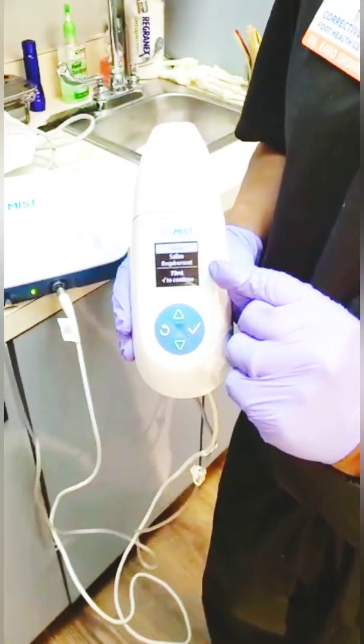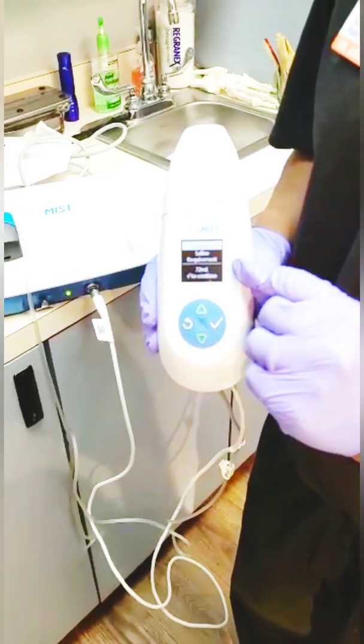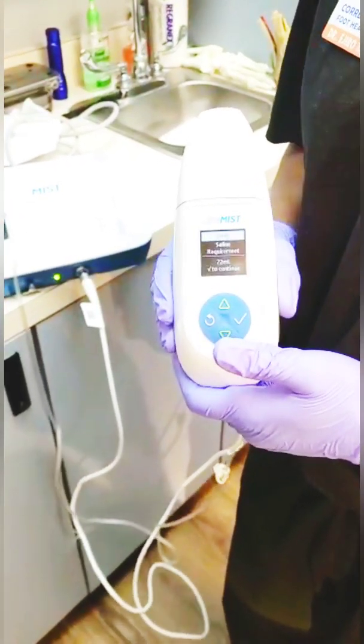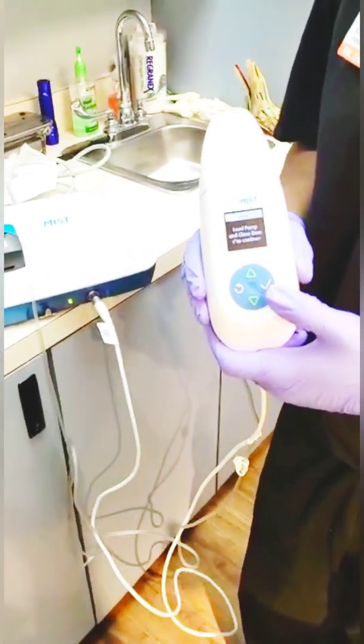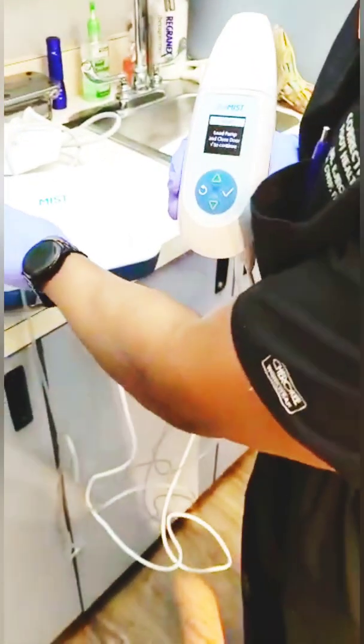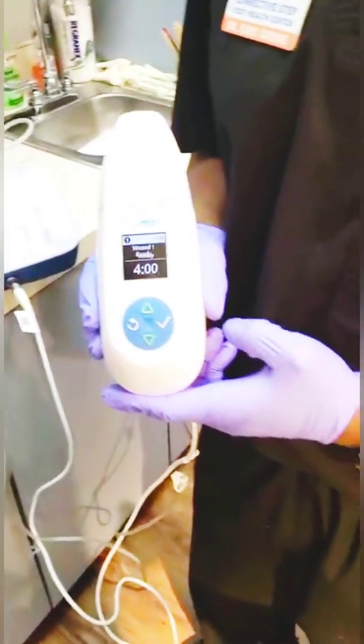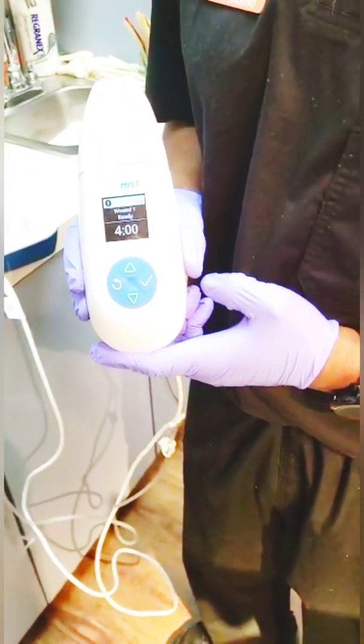The system tells us how much saline we need — we need 72 milliliters of saline, and we have approximately 250, so we have enough. Then it's going to set up, and it's telling us we have about four minutes of mist application.